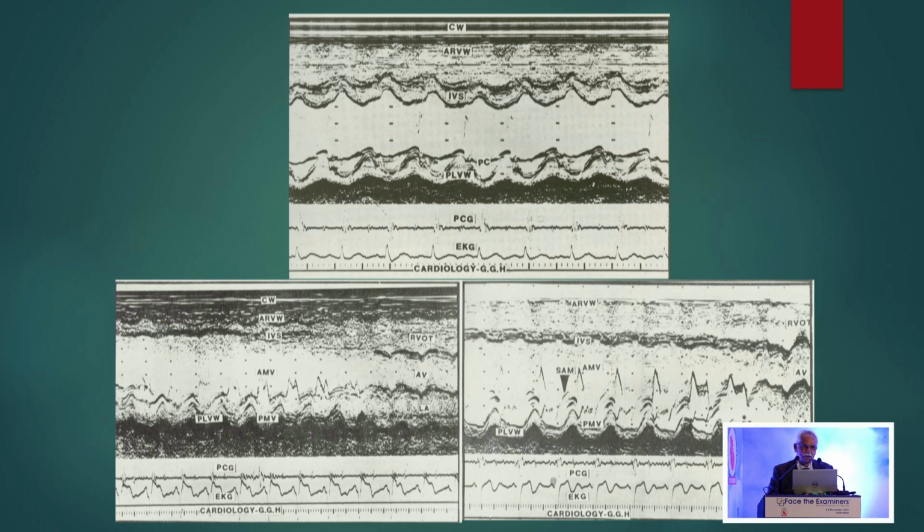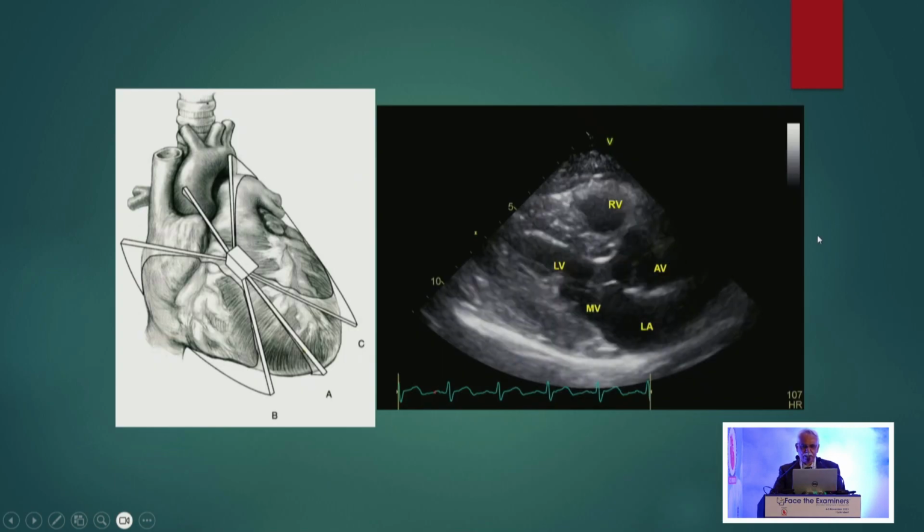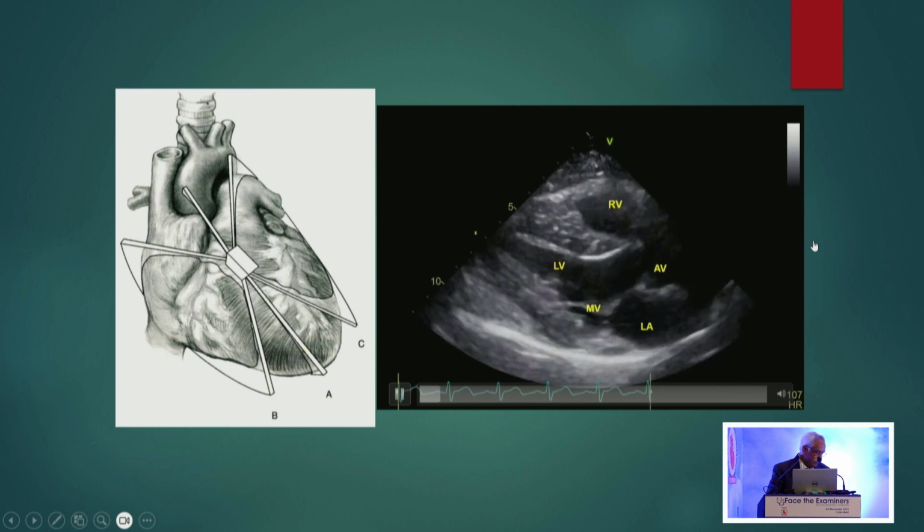That is about the global function of the left ventricle, especially left ventricular diameter, left ventricular volume, and the ejection fraction. Regional function: in the early echocardiographic days, we used to find out the thickness and how it thickens during systole and say this is normal. This is a patient in whom the interventricular septum is thinned out and not showing any thickening, so it is most probably infarcted. There is another patient in whom it is hypokinetic. Most probably the septum is normal in thickness and shows some thickening. So we can get an idea about the regional function by using the M-mode echocardiogram.